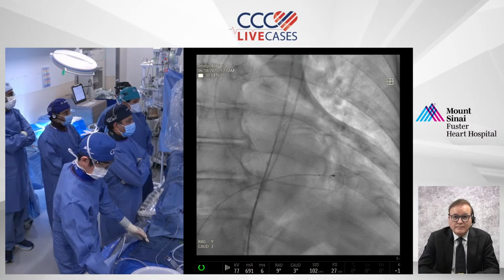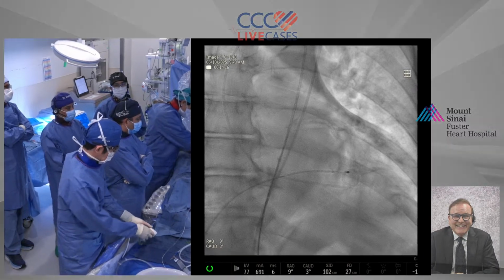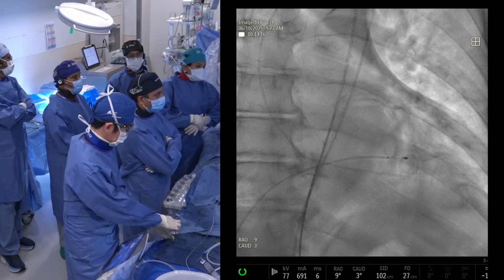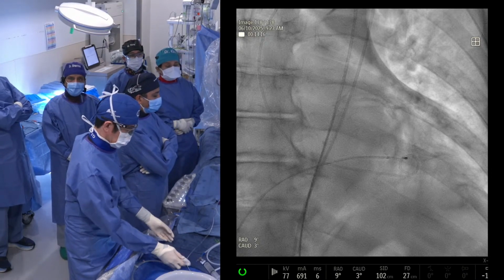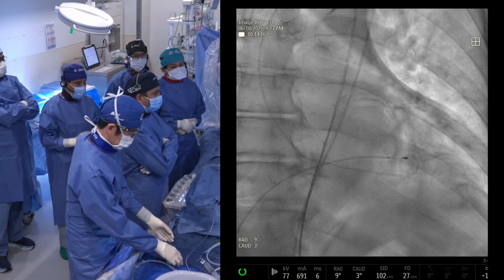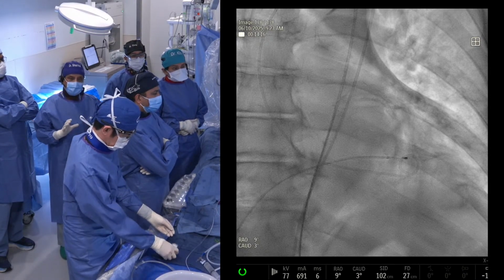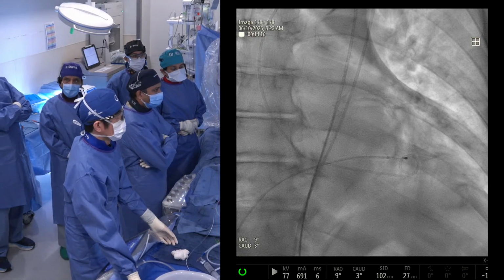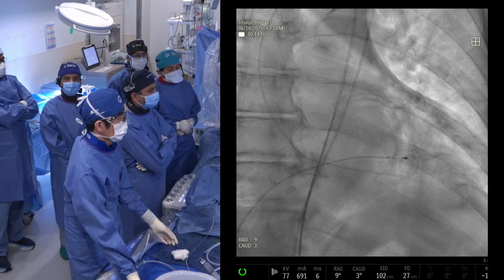Well, those are all the ongoing trials to answer that question. But I think the younger the patient, the less durability there is. Still, whether you do surgery or TAVR, we learned that as far as valve degeneration and durability, the data are identical. With the SAPIEN, with the Ultra Resilia for the surgical valve, there is very good literature, very little degeneration up to 8 years.